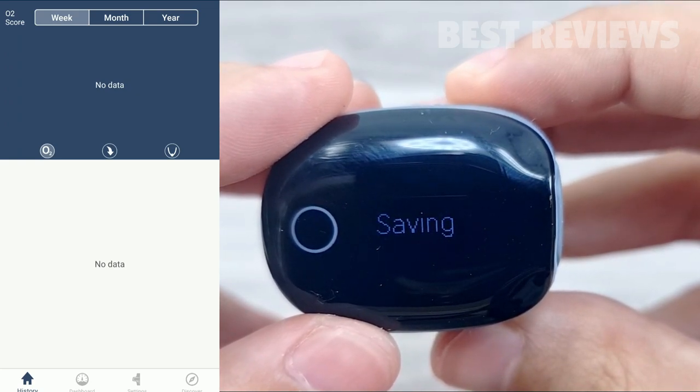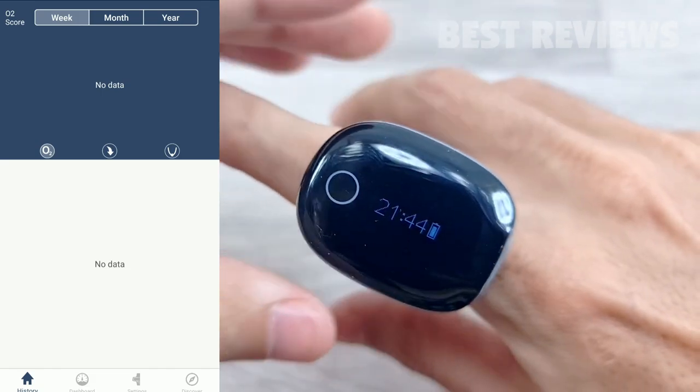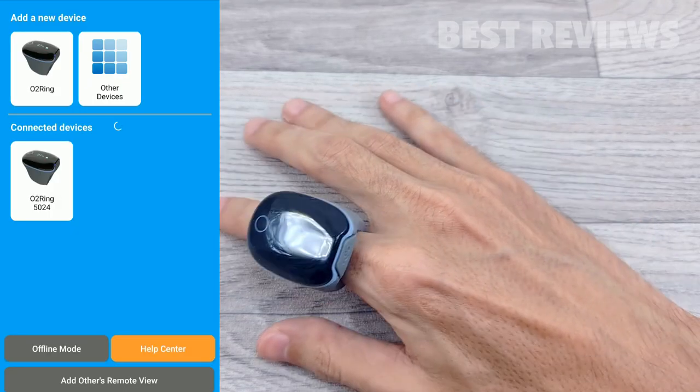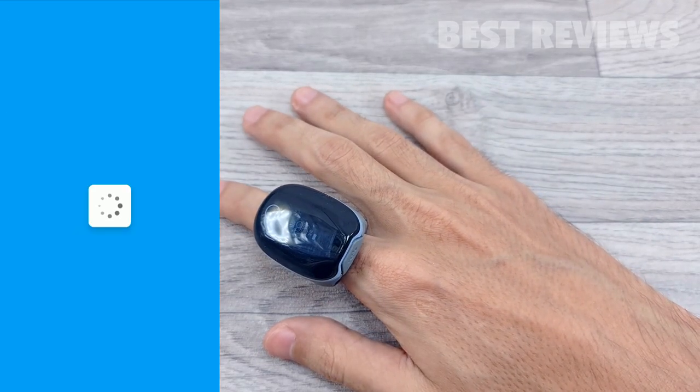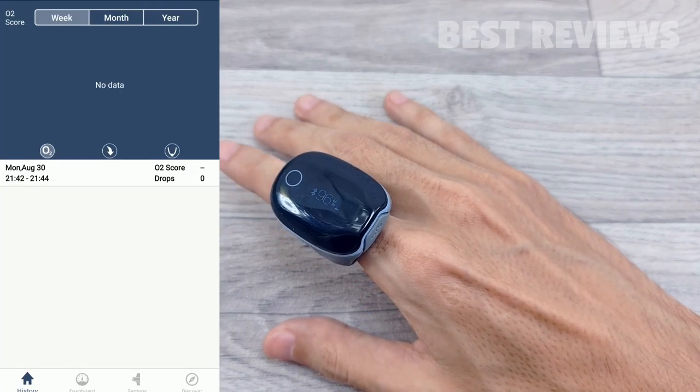Finally, there's the History tab. This is of interest to anyone who wants to view their overnight data on your phone or tablet screen, export your data via CSV, or share your sleep report with a medical professional for further analysis.